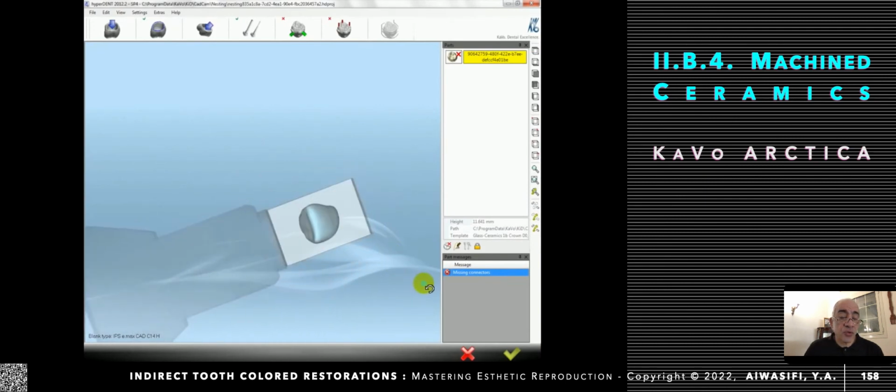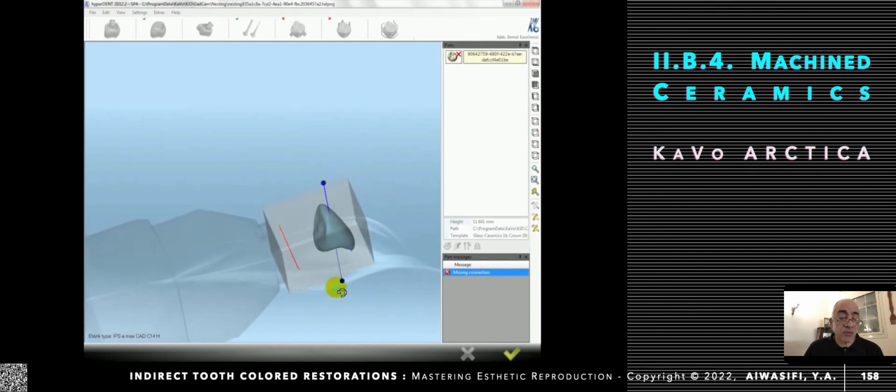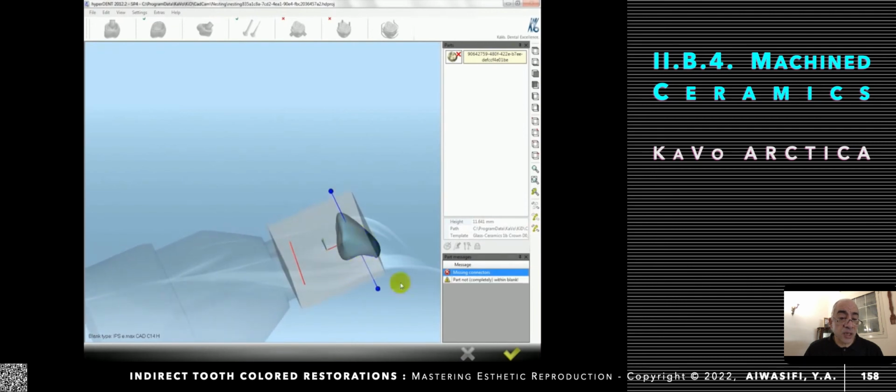This video shows you how you could get the maximum use of your block. You could put in this block more than one piece if you would like. It enables you to view it in 3 dimensions. Now when you move it out of your block, then come again to cut it, and you could place more than 2 pieces.